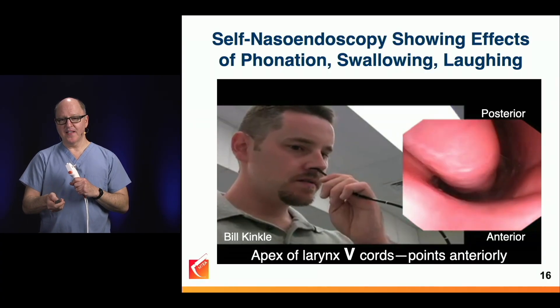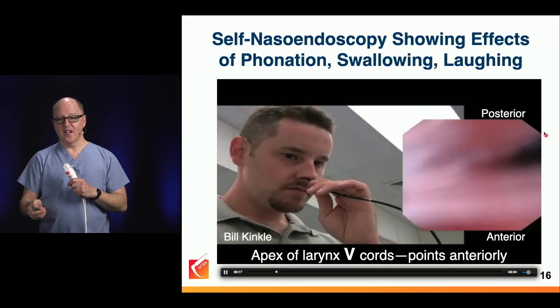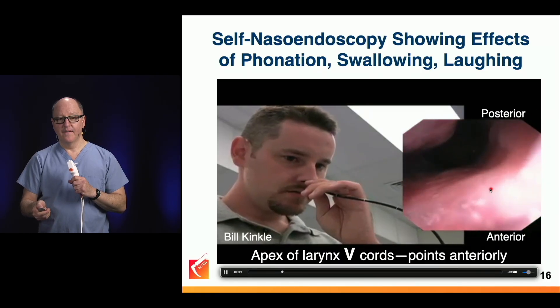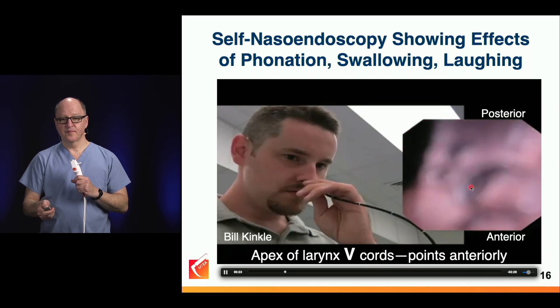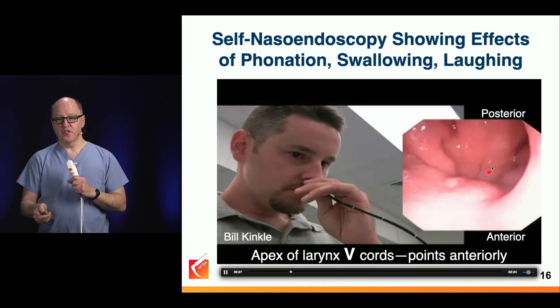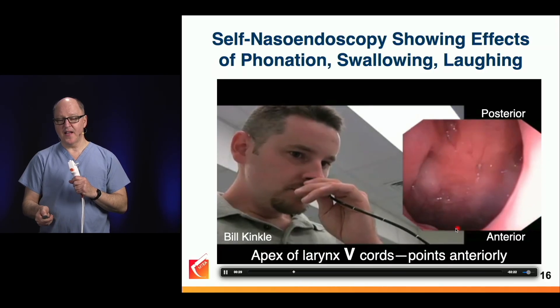So we're passing the inferior turbinate. We're in the right side, the septum's here. And now we exit the nasopharynx — Eustachian tube was there, posterior pharynx, soft palate.